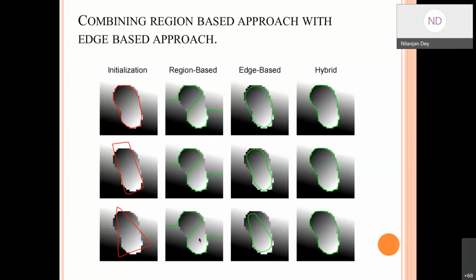Then after that it comes, see, this is an example of an active contour model. This is your input image, and initially we are trying to iterate. You are trying to fit a polynomial curve. After a certain number of iterations, it is trying to freeze that curve in such a way that the energy should be minimum. This was given by Kass and their group in '87. It's a long back algorithm, which is called the ACM or active contour model.